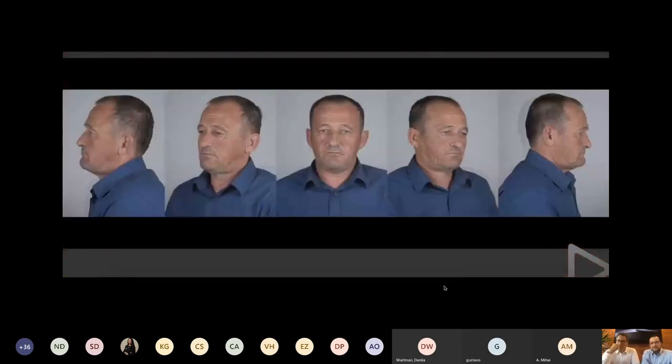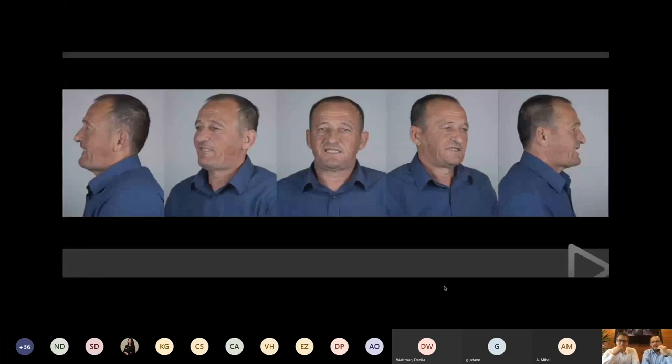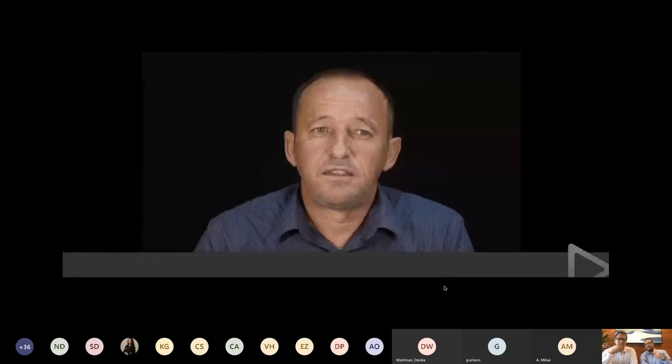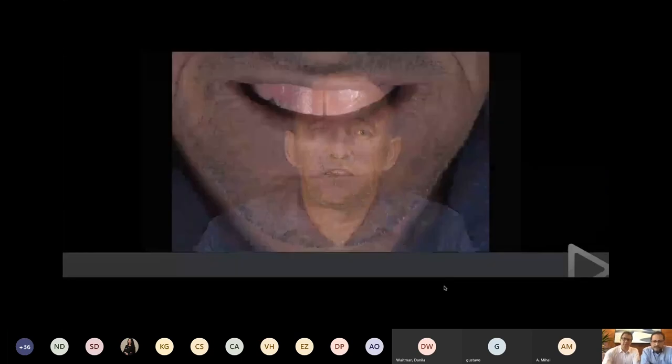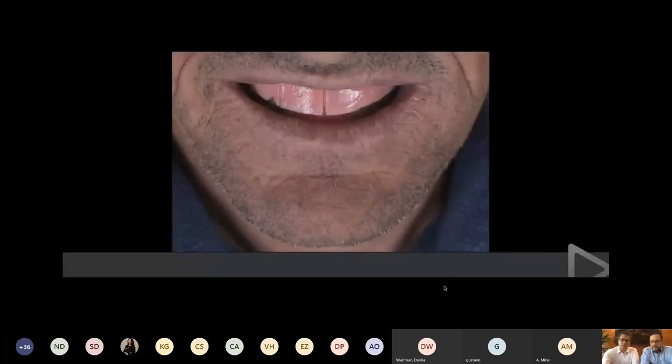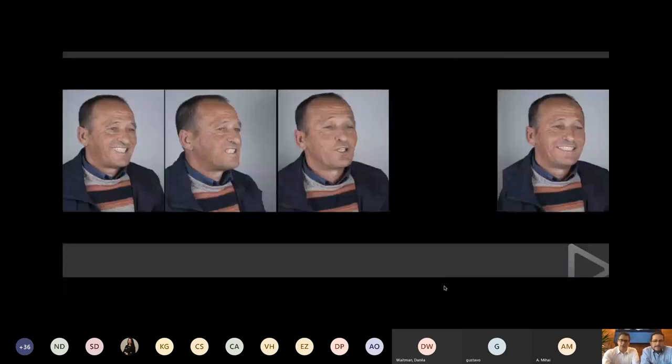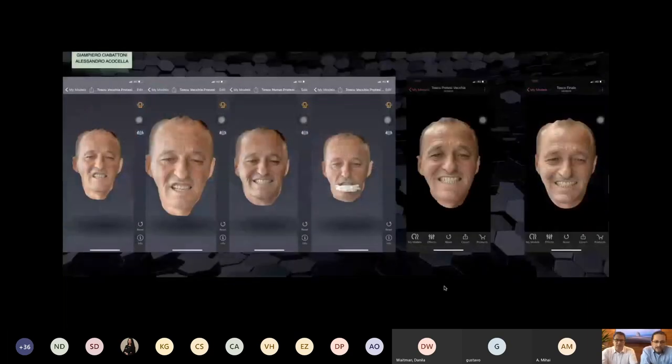And so we start playing as usual with Gian Piero, increasing our experience to manage this case, the full mouth edentulous patient wearing a not corrected denture. We made a new denture in the standard way with the new wax-up and all the traditional steps, choosing the right phonetics and aesthetic agreement from the patient. And then we can try to use this new application because we learned that it's an STL file.